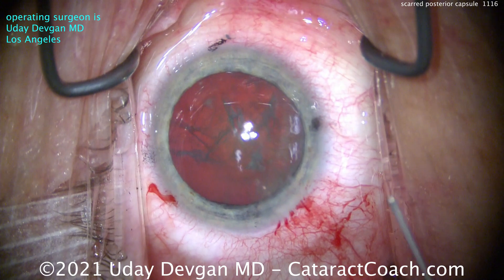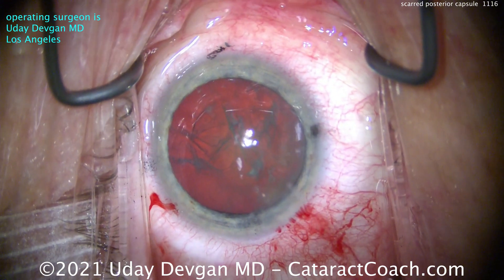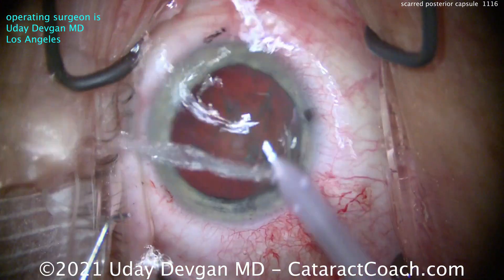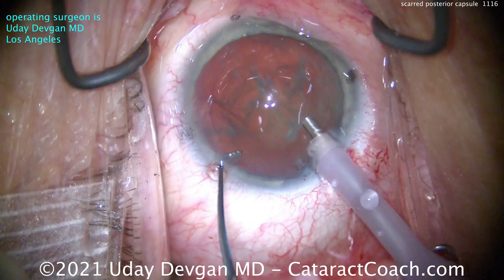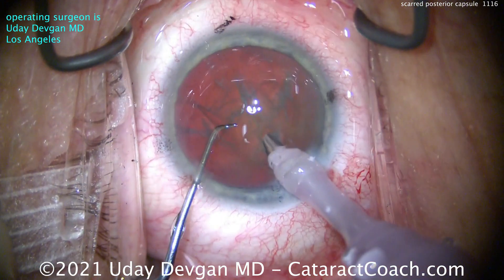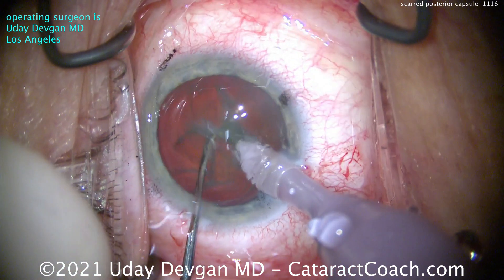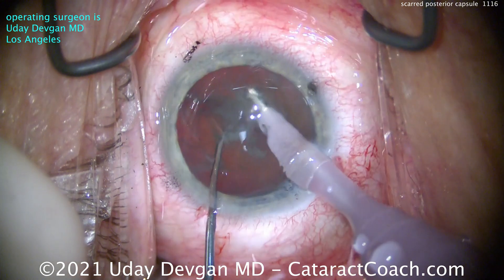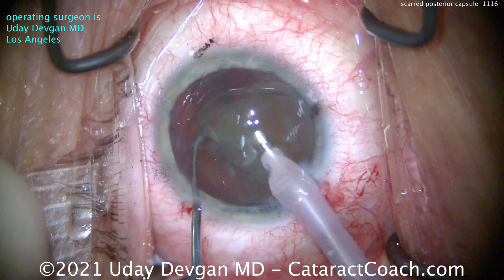We've also marked the cornea to line up a toric lens — this patient has two diopters of corneal astigmatism. It's very important that we get this toric lens in the capsular bag. Here's the phaco probe; I'll show you the first chop so you can see the nuclear density isn't too bad. Here's the initial chop — probe and chopper in — a combo chop. That's tolerable: moderate nuclear density, mostly posterior subcapsular. Let's fast forward to the end.